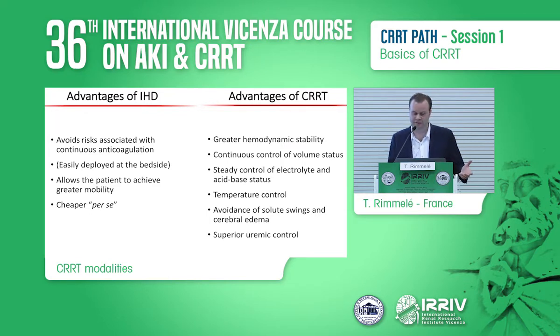The advantages of CRRT: greater hemodynamic stability, better control of the volume status, a steady control of electrolyte and acid-base status, a good control of the temperature. CRRT avoids the solute swings and cerebral edema, which is very important if you have a patient with traumatic brain injury, and also provides a superior uremic control.